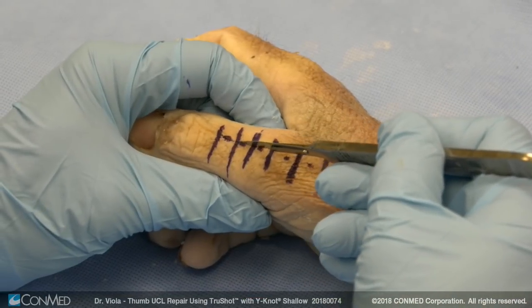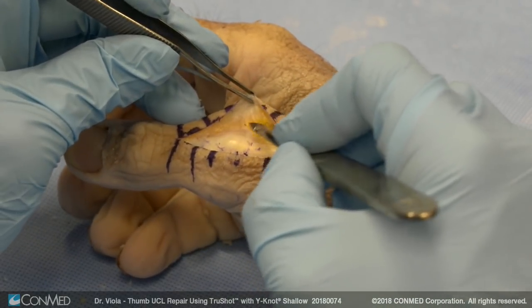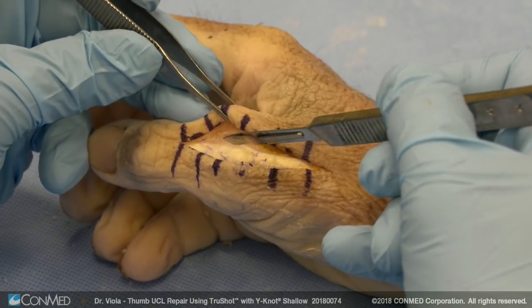We make a longitudinal incision directly over the dorsal ulnar aspect of the thumb MP joint and we expose the EPL tendon. One approach is to split the ulnar sagittal band off the edge of the tendon.